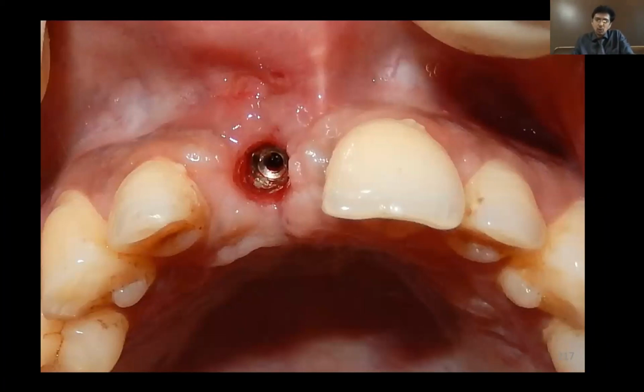So soft tissues are the shield of bone. Doing connective tissue grafting around an implant is actually easier than doing it around natural teeth. Stabilizing a CT is actually easier. CT grafting around an implant can be done at any stage, many a time at the preliminary stage itself. If the patient is ready, you can tell the patient beforehand that this tissue thickness has to be increased, then only I can place the implant. It can also be done at the implant placement stage, though the surgery would be huge, meaning implant placement and then connective tissue also. The third stage, which I demonstrated just now, is at the second stage surgery.